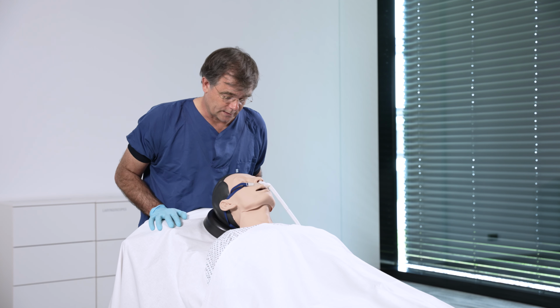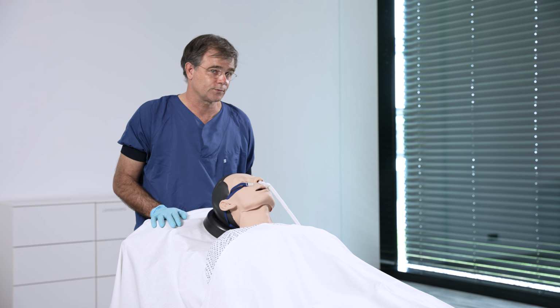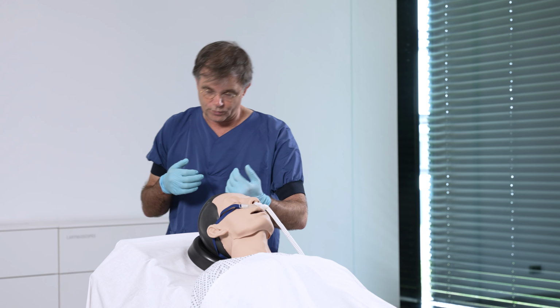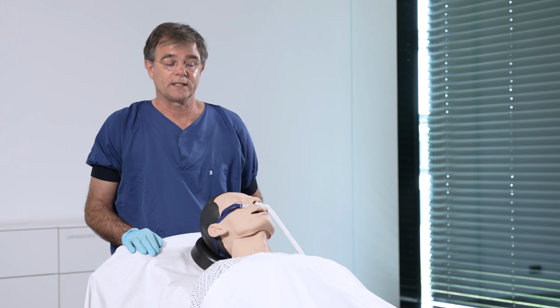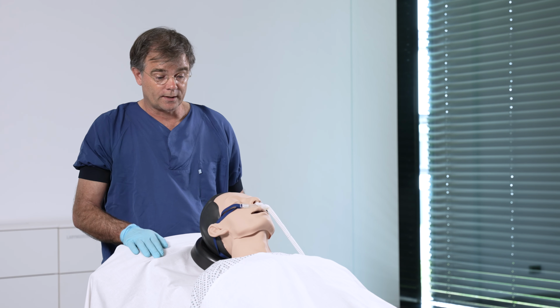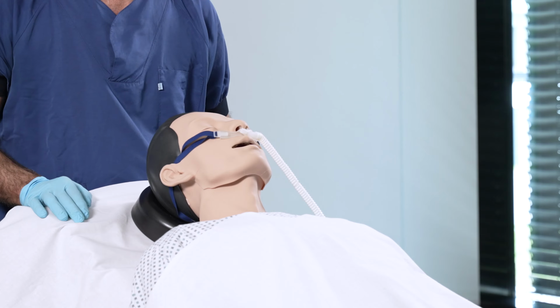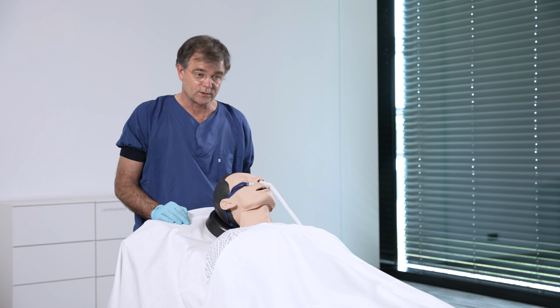Today I will show you a tip and a trick with the video laryngoscope, how we can use it for awake tracheal intubation. There are patients who cannot lie flat, or we cannot approach from the back side of the body. We can approach them only face to face from this side of the patient. For example, patients who are obese or patients who cannot lie flat. For example, this patient has high flow nasal oxygen at 60 liters per minute. He's dyspnoeic and we have to intubate him face to face awake.